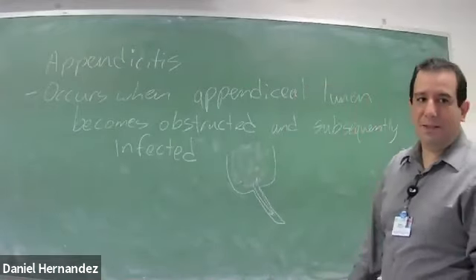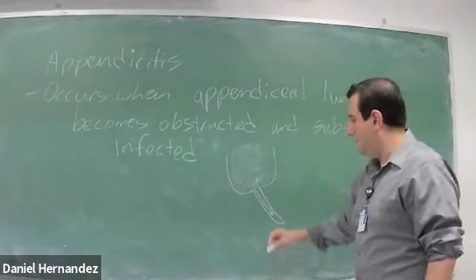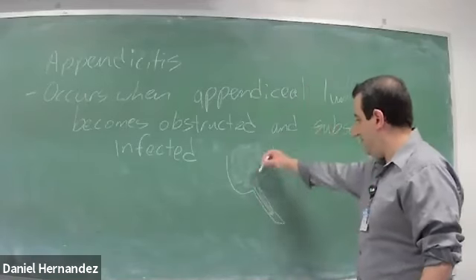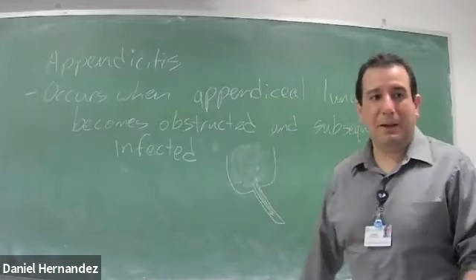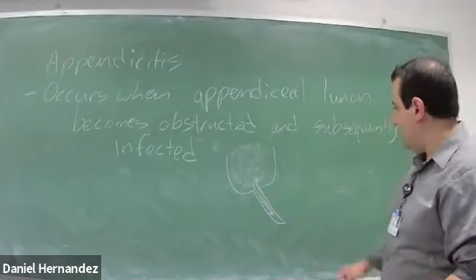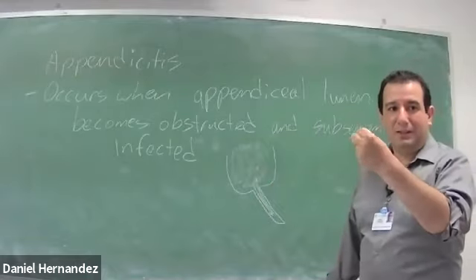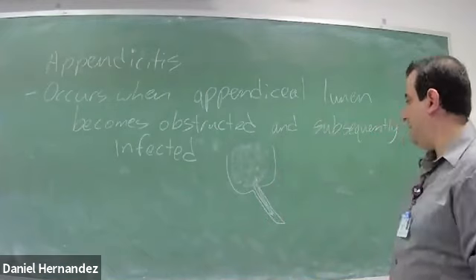I've seen cases where they have a lot of fluid within the cecum. I can actually visualize fecal material coming into the appendix and coming out, kind of swishing back and forth. But remember, the appendix does not peristalse, so it does not contract. Even though it looks like stuff is coming in and out, you're not going to see peristalsis of the appendix.